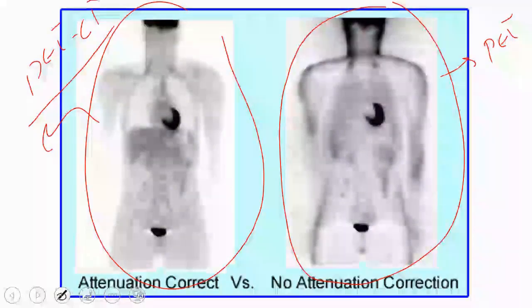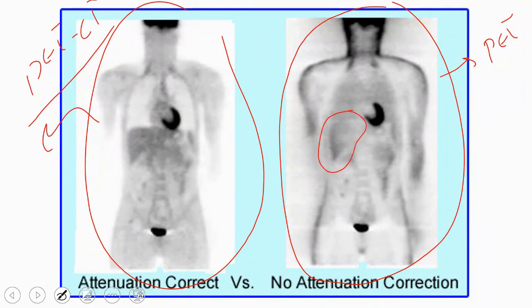When I know the amount of attenuation for the liver, I will reference the count. For example, in this image, the liver has low activity or is not illuminated. This image is inverted. The darker it is, the higher the activity. This is similar for the heart and the bladder.